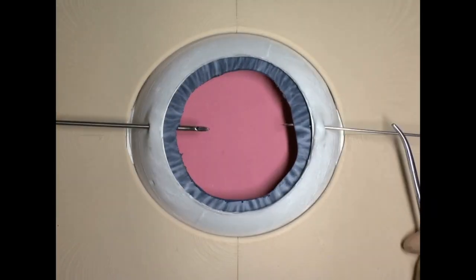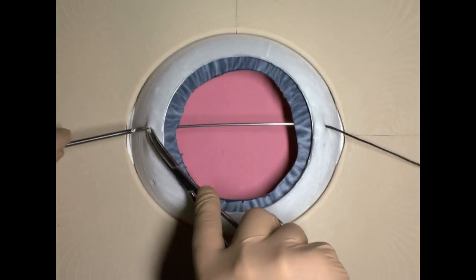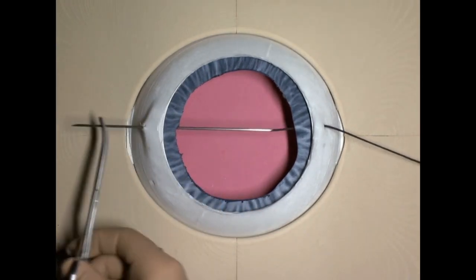Fixation by an ab-interno suture was shown in AC anchor fixation. Now we will demonstrate one of the ab-externo suture fixations.